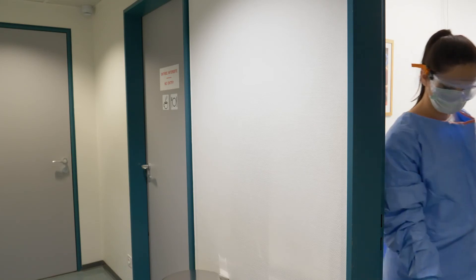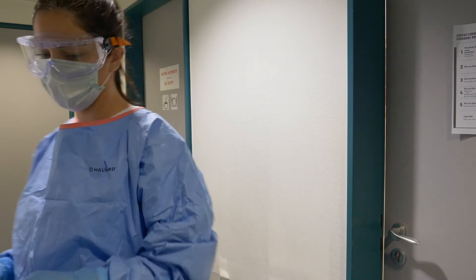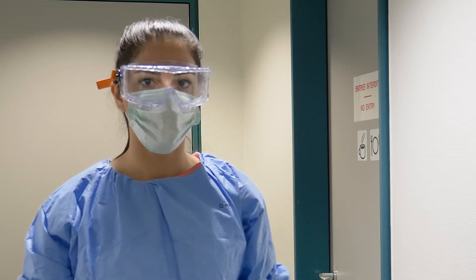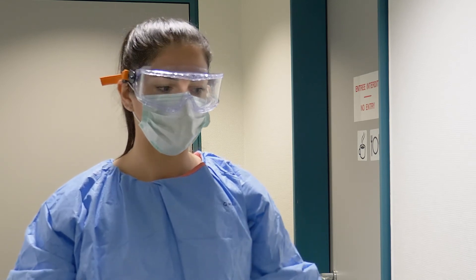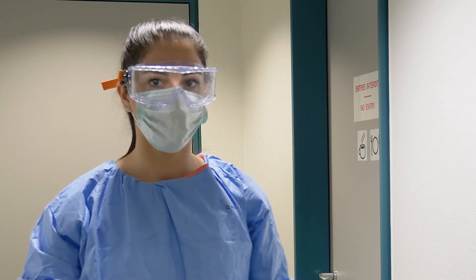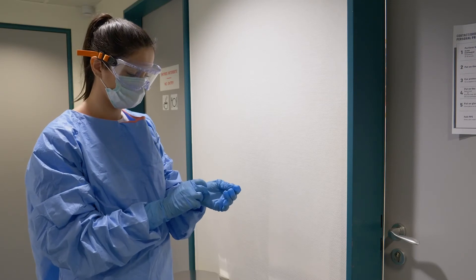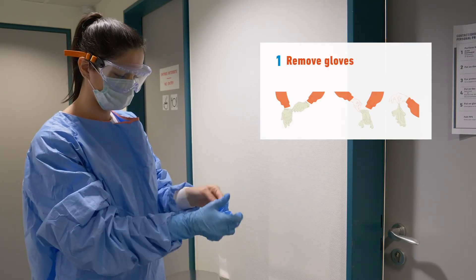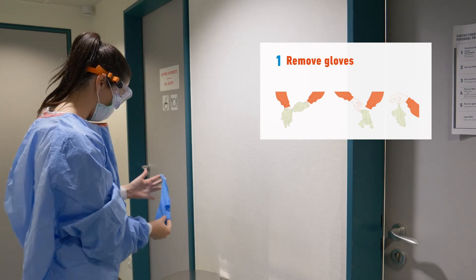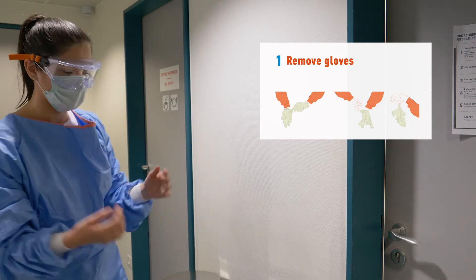You are now ready to remove your PPE. Keep in mind the removal of PPE poses the highest risk of transmission to healthcare workers. Make sure to avoid any contact between potentially contaminated PPE and your clothes, skin, and especially your face. Respect the order indicated, in front of a colleague or mirror if possible. The first step is to remove the gloves using the glove-to-glove and skin-to-skin technique, as this is the most soiled item which needs to be removed first and discarded safely.